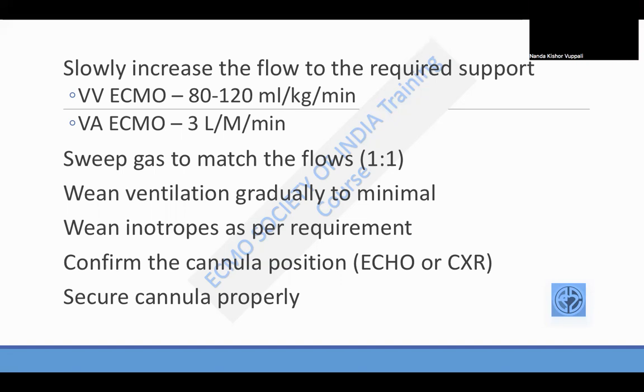If it's a venous mode of ECMO, generally we should be able to come off all the inotropes, because usually that inotrope requirement is because of hypoxemia, and once you correct hypoxemia, the inotrope requirement should go down. In a veno-arterial mode of ECMO, where you've initiated ECMO for a weak heart, poor heart function, you might need some amount of inotropy for the heart to function. But we probably may need to come off vasopressors, but leave some amount of inotropy in the background.